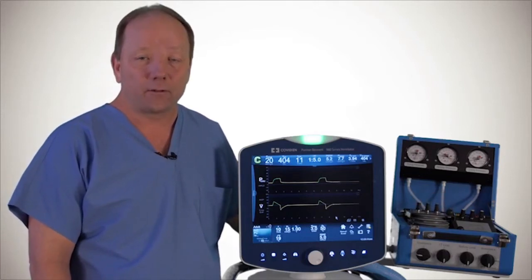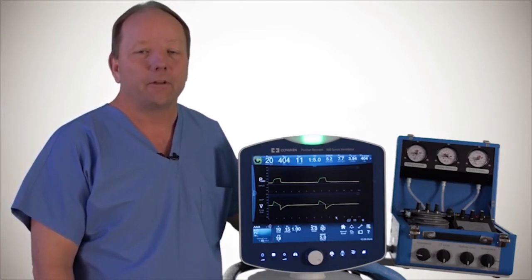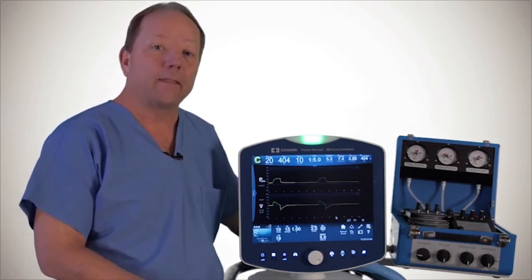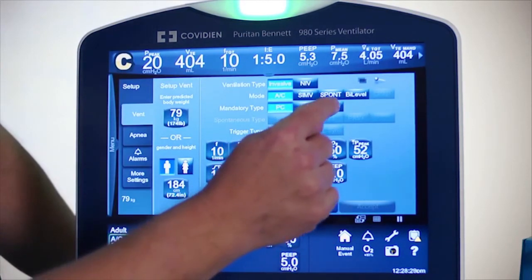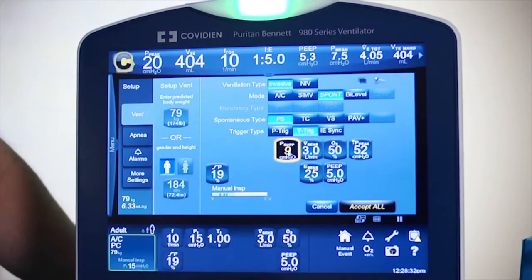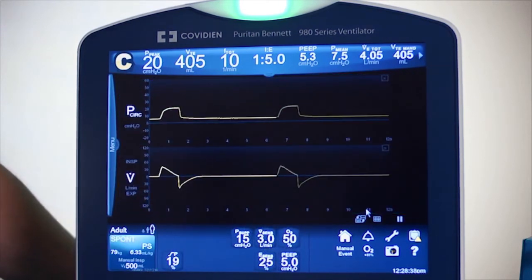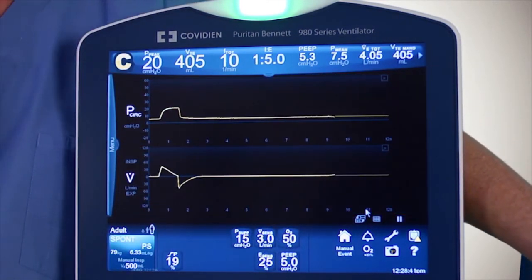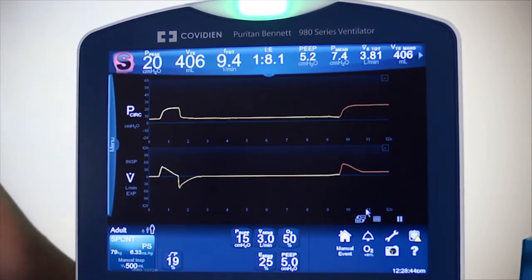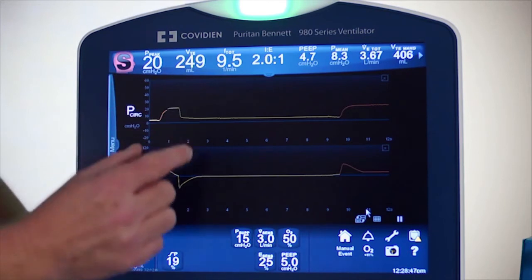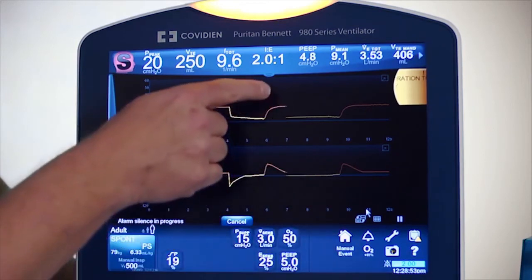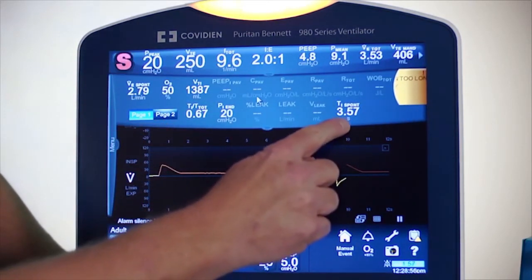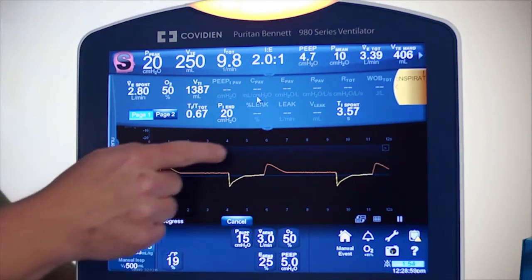Now I want to talk about how LeakSync works to help reduce the amount of delayed cycling. To do that, I'm going to move over to pressure support and then recreate a leak. I'll touch Vent Setup, select Spontaneous, and put in some pressure support. With that leak, we can see that inspiration is lasting very, very long — if I look at that inspiratory time, it is right now 3.57 seconds, which is a fairly long period.